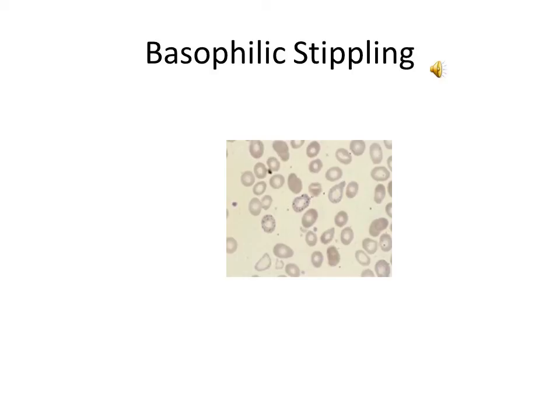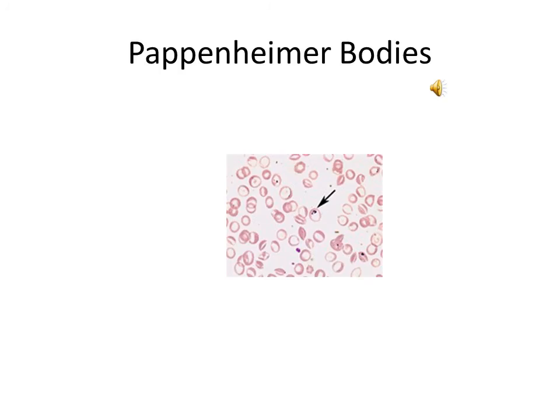It's important not to confuse basophilic stippling with Pappenheimer bodies. Basophilic stippling appears homogeneously all over the cell. Pappenheimer bodies tend to appear as clusters in the cell periphery. Pappenheimer bodies appear in clusters as if they have been gently placed on the red cell membrane.